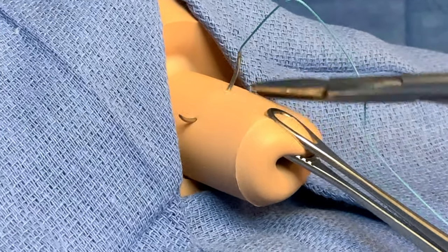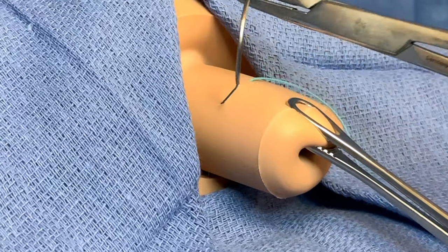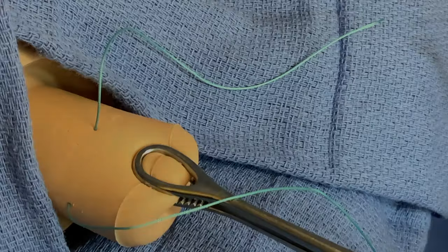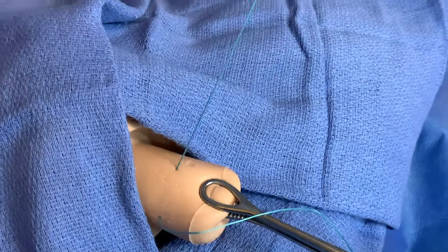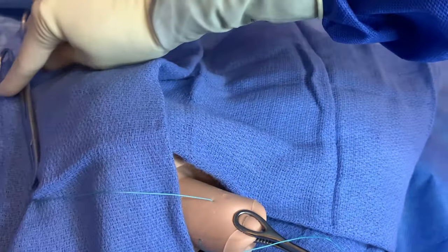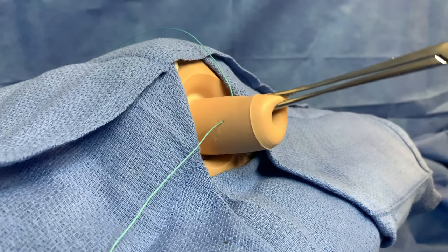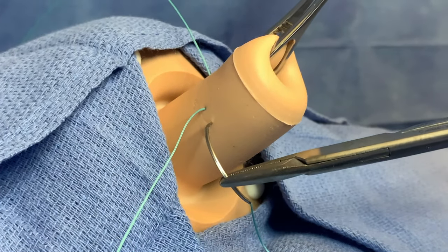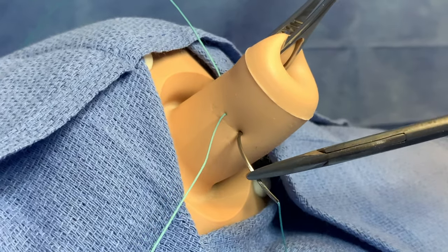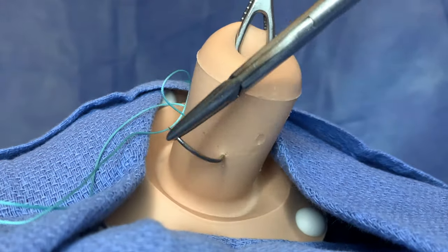The needle is dexterously passed through around 10 o'clock. The tail of the suture is secured with a hemostat and placed on the patient's abdomen to prevent accidental pulling out of the suture. After repositioning the needle and elevating the cervix anteriorly with a ring forcep, the next suture inserts at 8 o'clock, avoiding the cervical vessels at 9 o'clock.